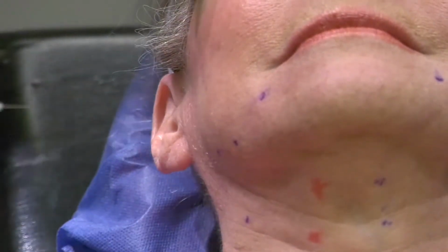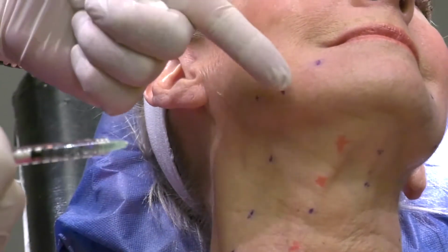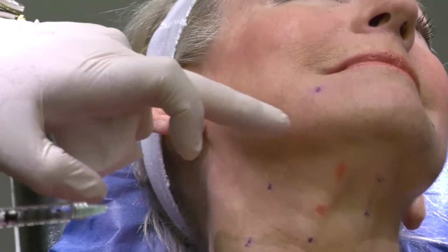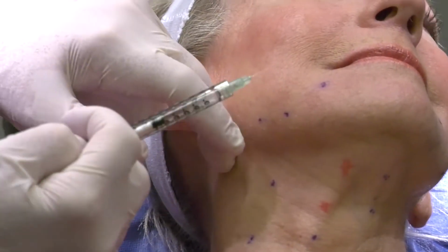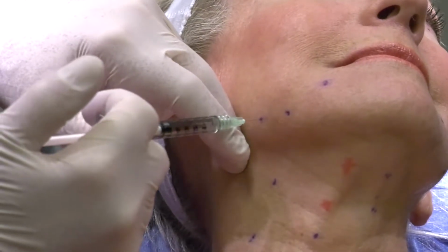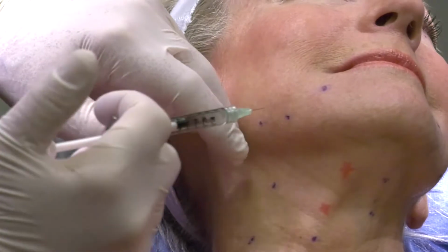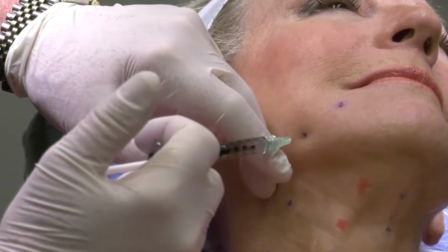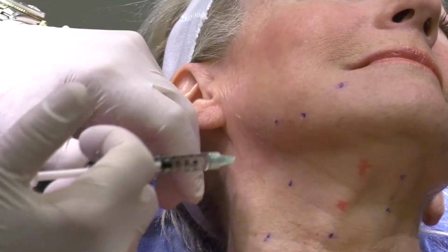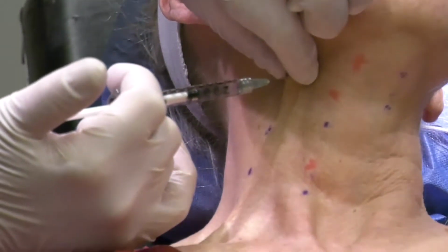And we'll do the end. Just turn your head a little bit that way. Perfect. And again, just to lessen the activity of the platysma, I think you have to incorporate the insertion onto the mandible. These are very simple injections.